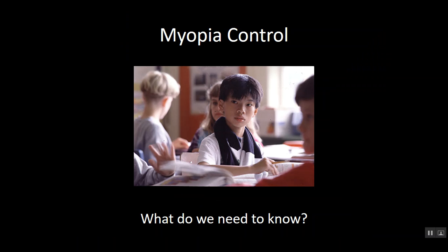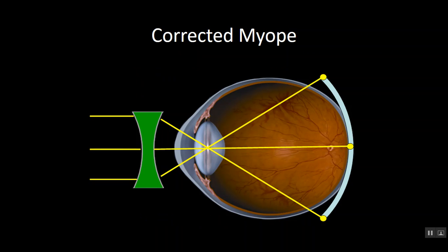Now, it's not just the presbyope that we fit with multifocal lenses. We also fit our multifocals on our emerging myopes. And one of the issues that we see with the emerging myope is this great increase in myopia in the next generation of kids. That, in other words, there's greater frequency of myopia, and there's also a greater severity or higher rate of myopia happening.